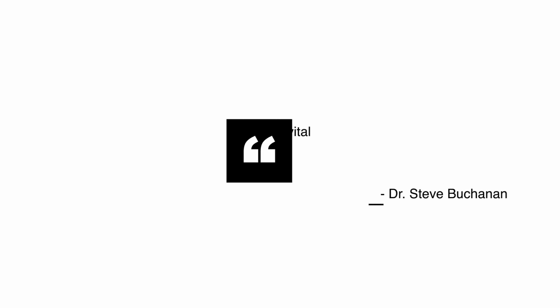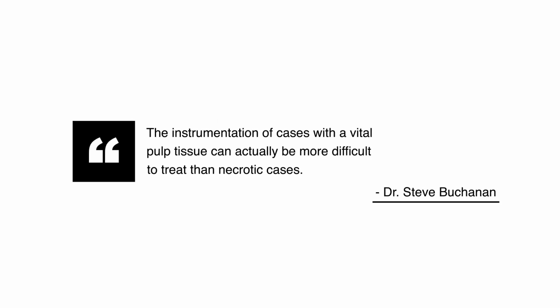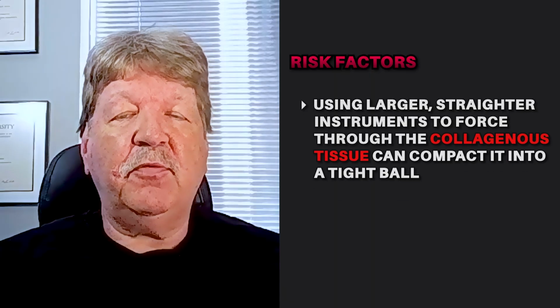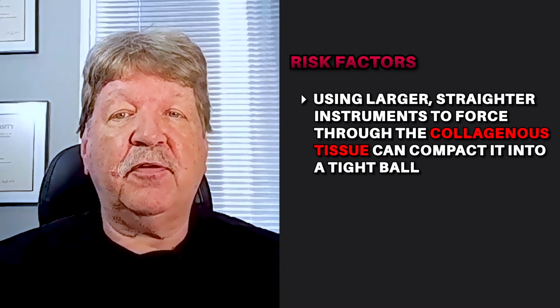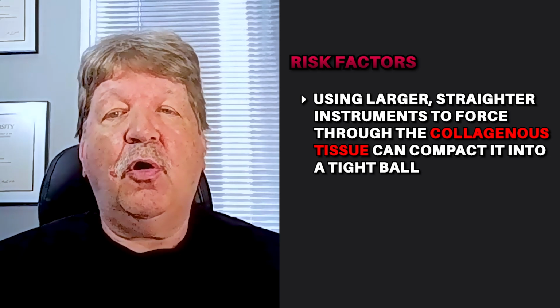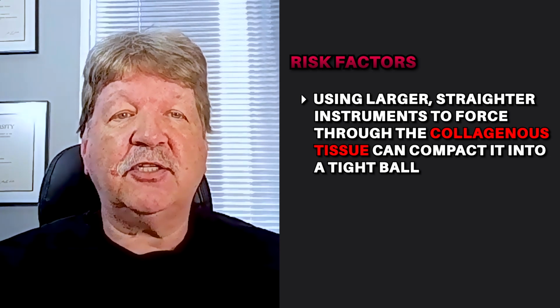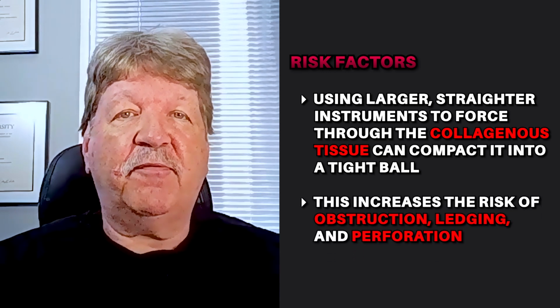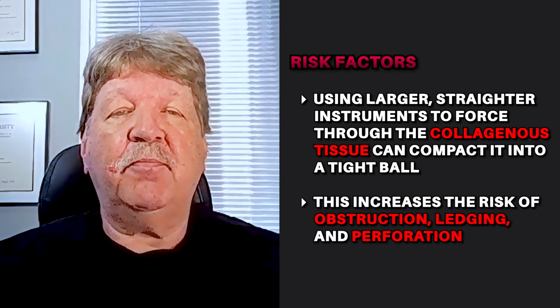I believe the endodontist Dr. Steve Buchanan once said that instrumentation of cases with the vital pulp can actually be more difficult to treat than necrotic cases. In vital cases, the tissues can be much tougher to remove. Continuing to place larger, straighter, stiffer instruments into the canal to force your way through the collagen only serves to compact this collagenous tissue into a nice tight ball and increase the risk of obstruction, ledging, and perforation.